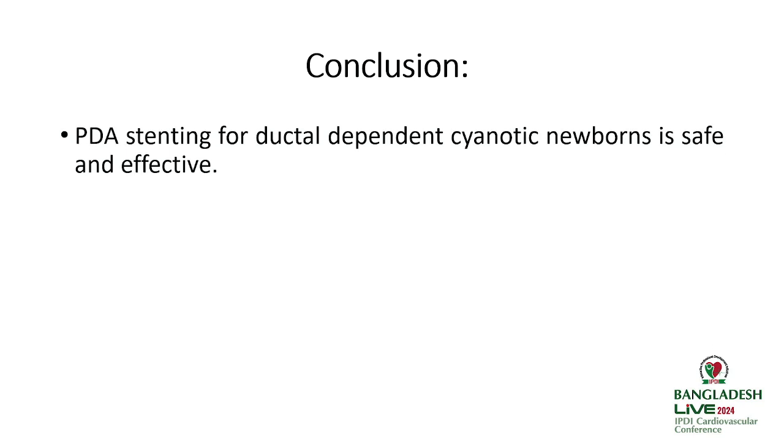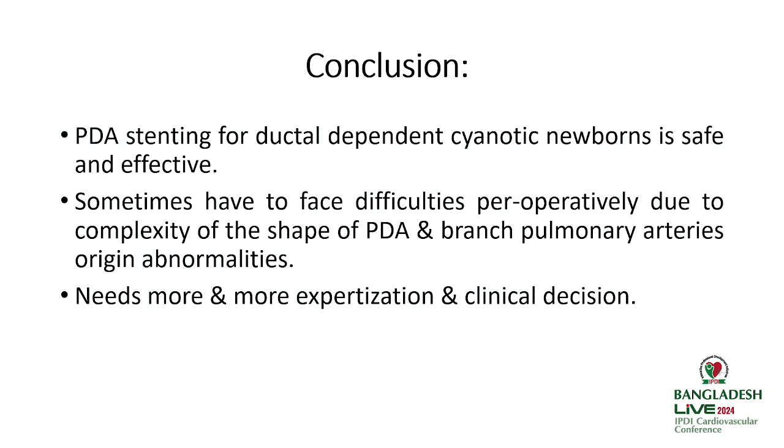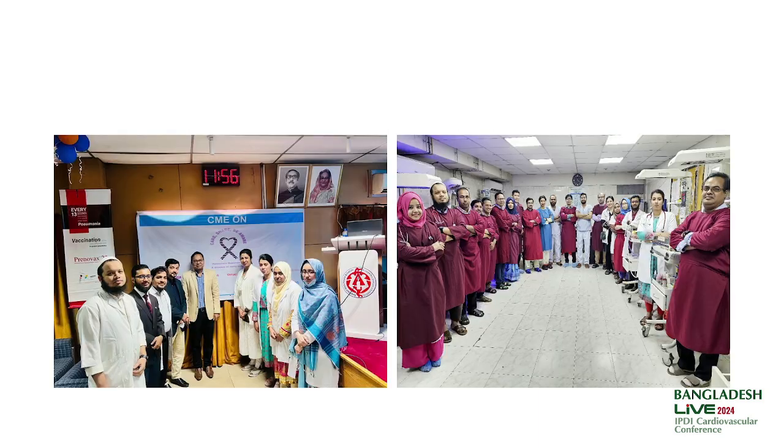So PDA stenting for ductal-dependent pulmonary circulation is safe and effective. Some patients face difficulties periprocedurally due to the complexity of the shape of the PDA and pulmonary artery origin abnormalities. It needs more and more expertise and clinical decision-making.